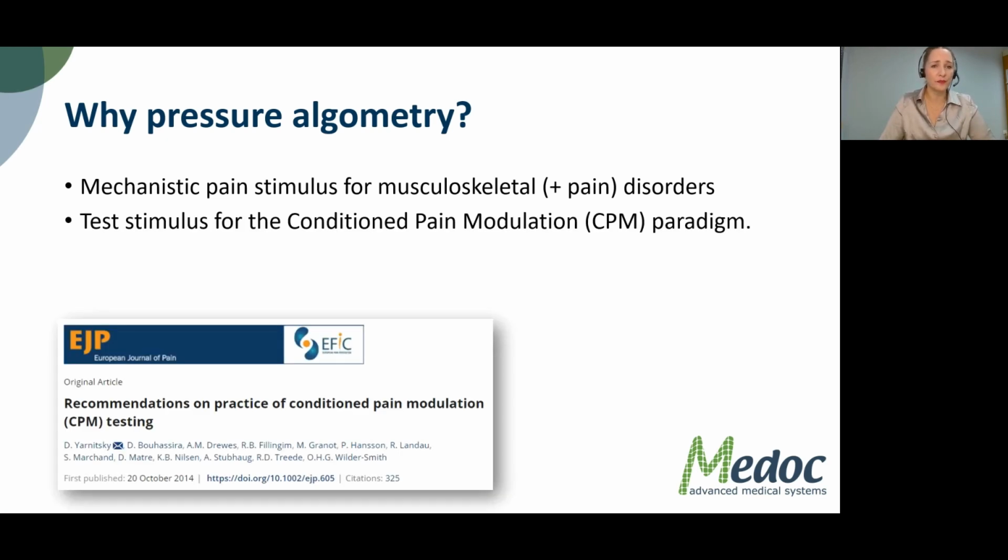Another reason to use pressure algometry is to use it as a test stimulus for the conditioned pain modulation paradigm. And for those who are not very familiar with conditioned pain modulation, CPM, this is a measure of descending pain inhibition.